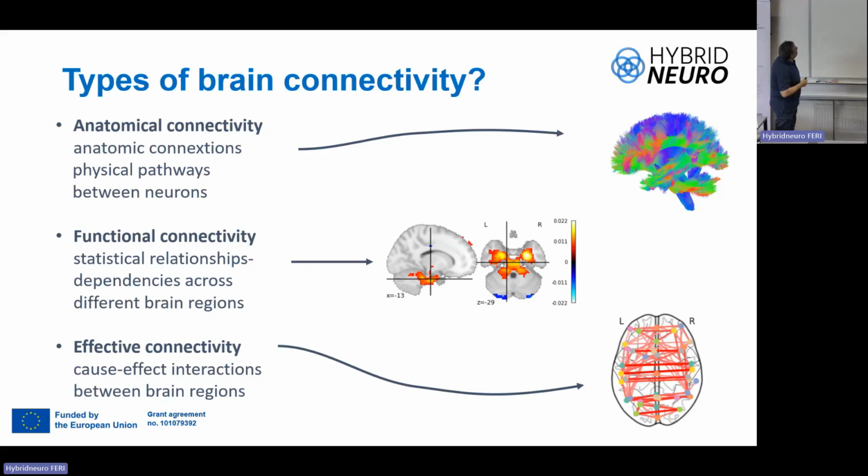Functional connectivity and effective connectivity. Functional connectivity, as engineers, we try to analyze statistical relationships in different brain regions. So in this case, very simple. We touch one electrode and a second electrode, and we try to analyze the interaction, statistical dependencies between them. So we consider that we analyze the connection between the region of one electrode with respect to the other.